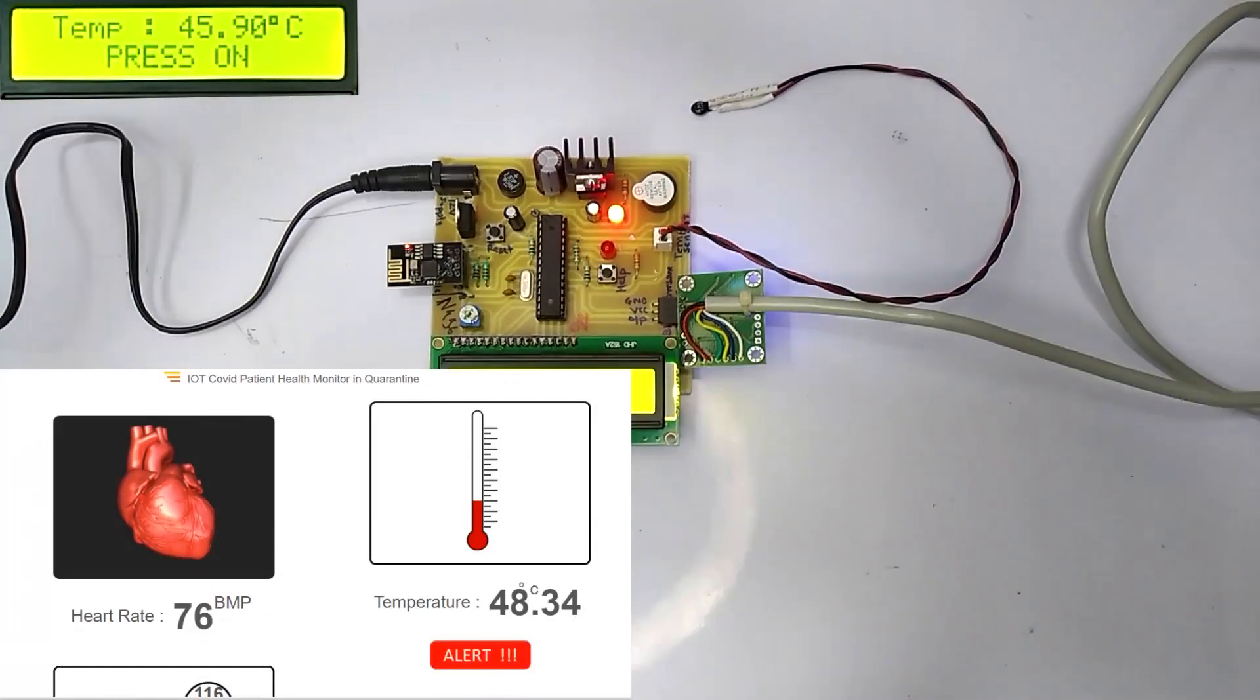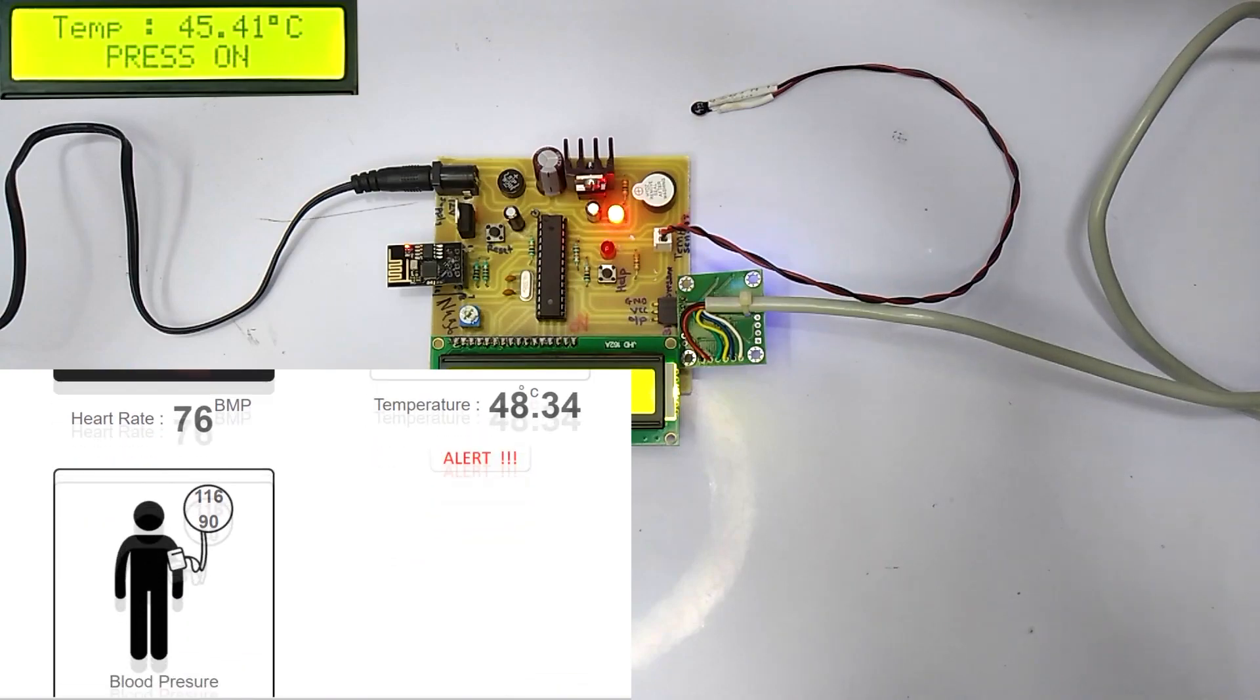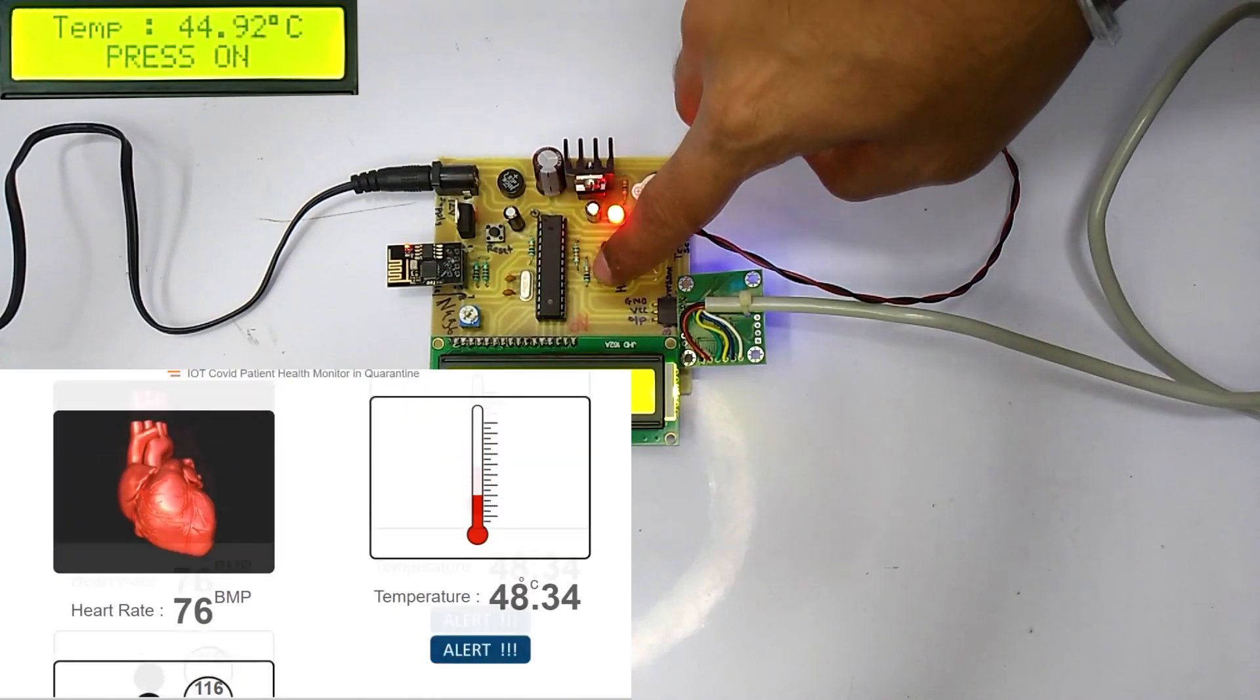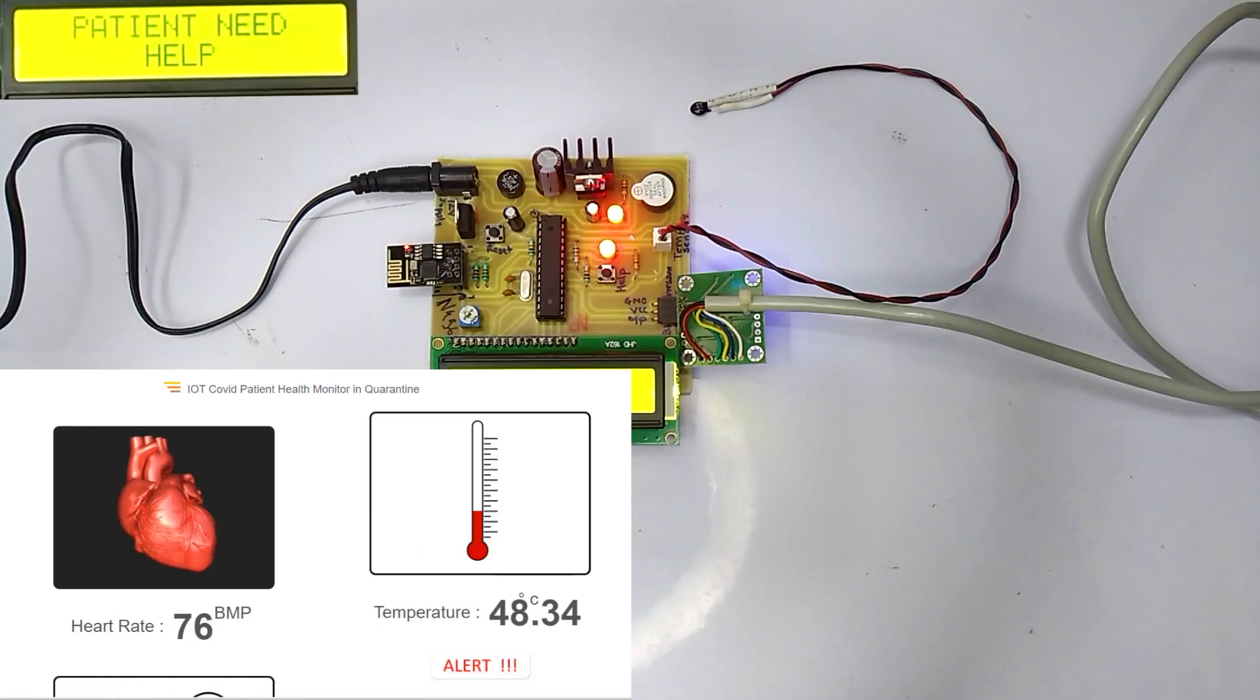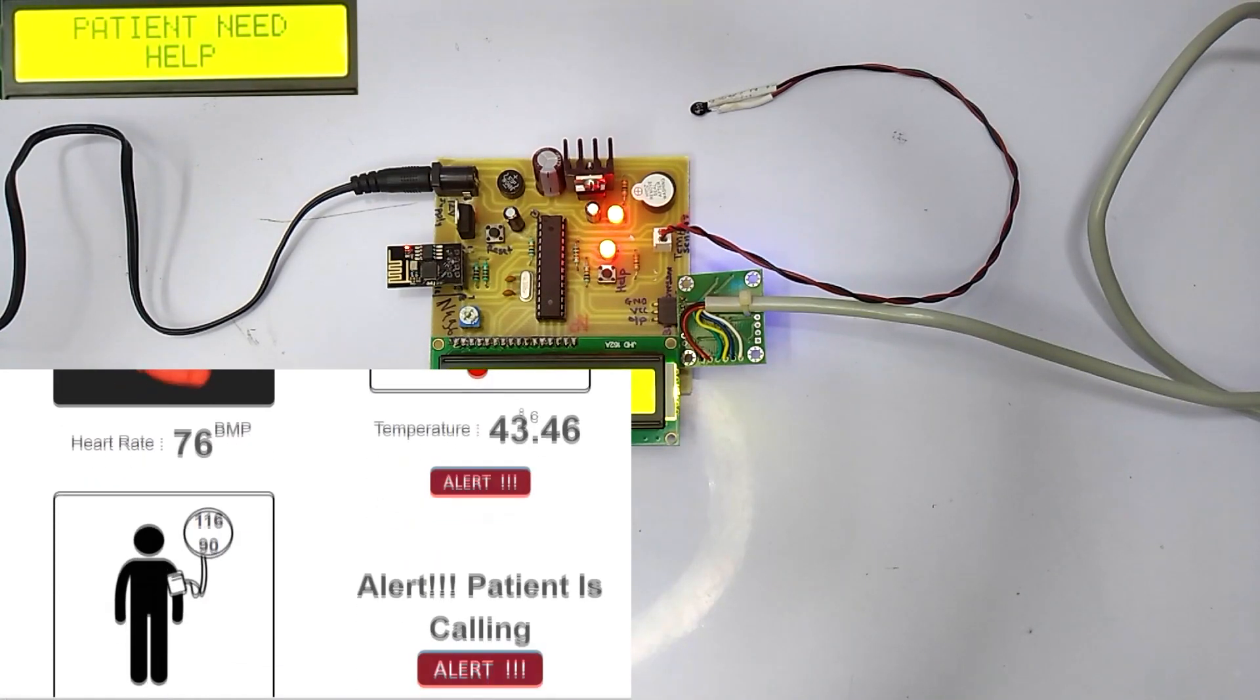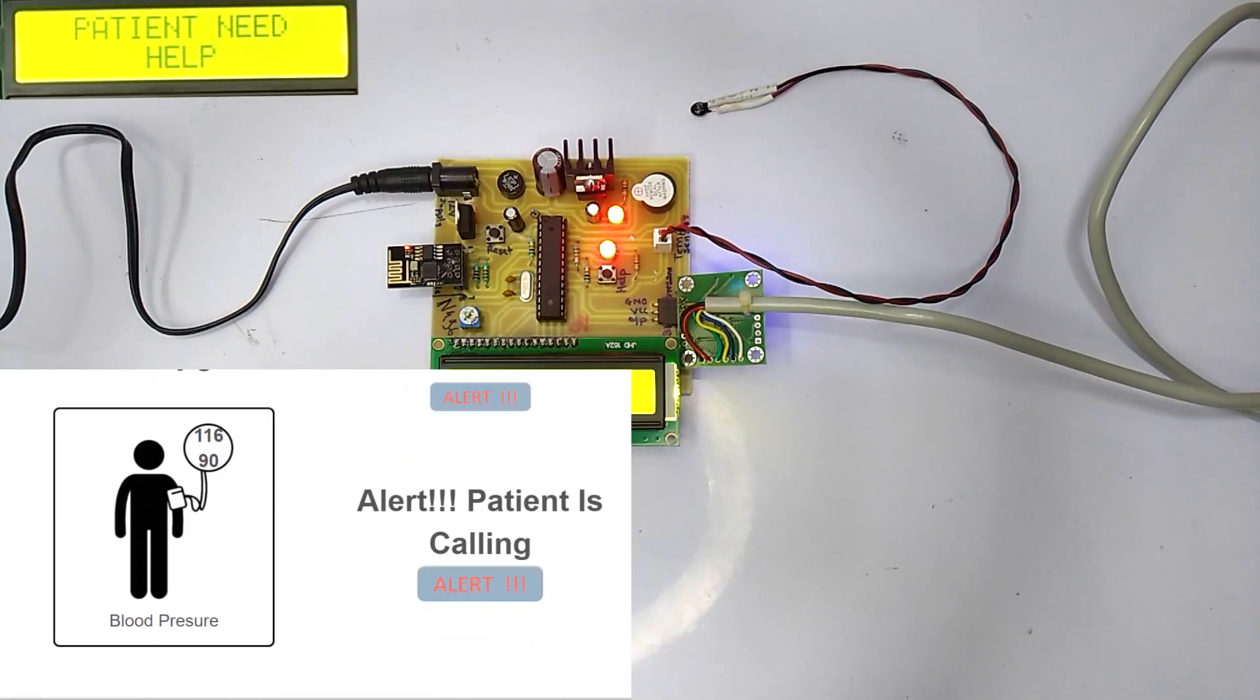If the patient needs any medical help, we can assist the patient by pressing the help button attached to the system. Let's press the help button attached to the system. The request for emergency medical assistance is sent to the respective authorities, and hence with this system we can provide proper treatment as soon as possible.